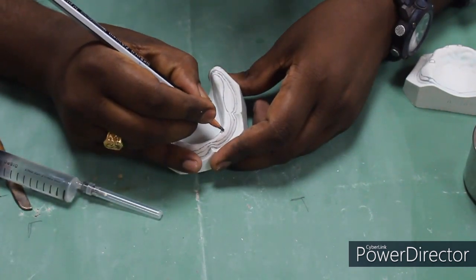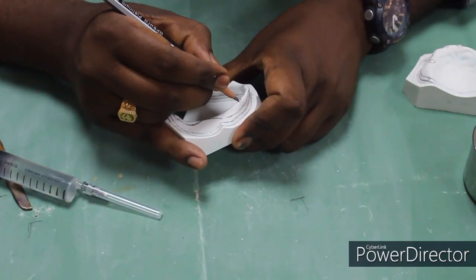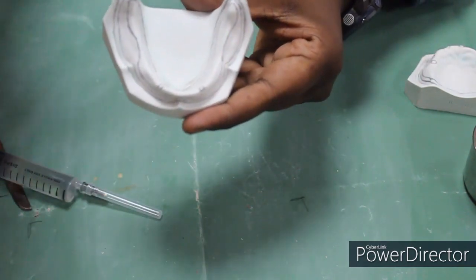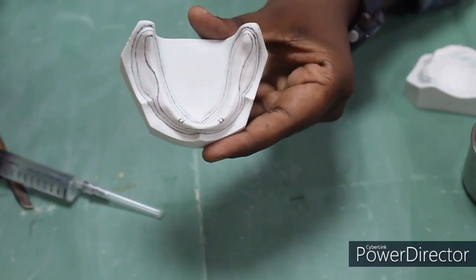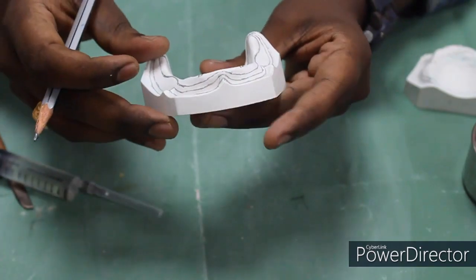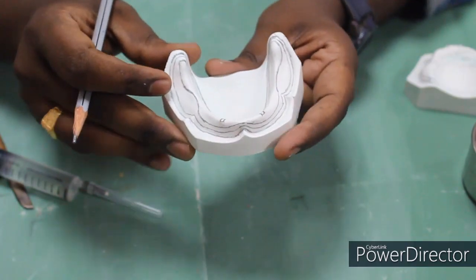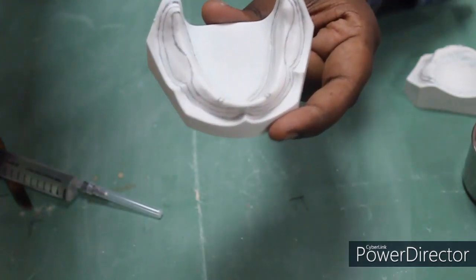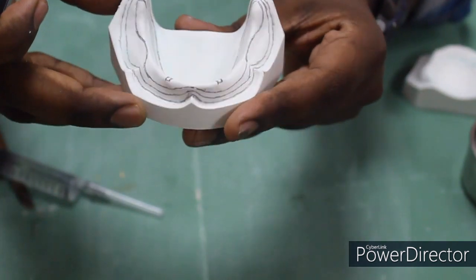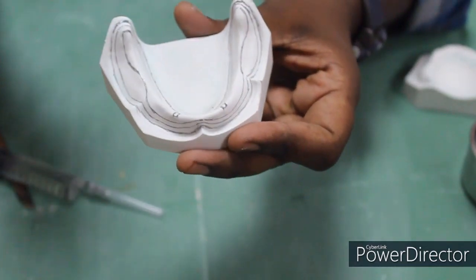So in the canine region, we can add two stoppers, that is 2 by 2 millimeter dimension, in the canine region. Okay, so by this we are completing the spacer design outline for the maxillary and mandibular cast. Three lines, and each will be 2 mm short, and you are exposing the buccal shelf area and stoppers in the canine region.